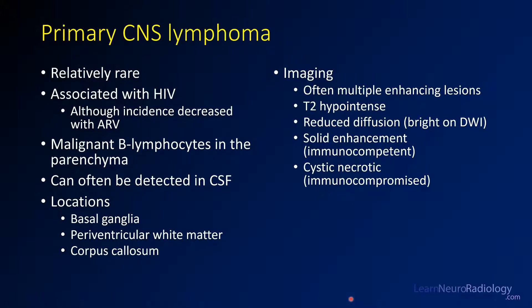This is a case of primary CNS lymphoma. It's a relatively rare disorder with a relatively dismal prognosis. It's associated with HIV, although the incidence is decreasing with better HIV treatment. Most commonly it's a B-cell lymphoma that directly invades the parenchyma. Often, a lumbar puncture will yield malignant cells in the CSF. Common locations include the basal ganglia and periventricular white matter, as seen in this case.